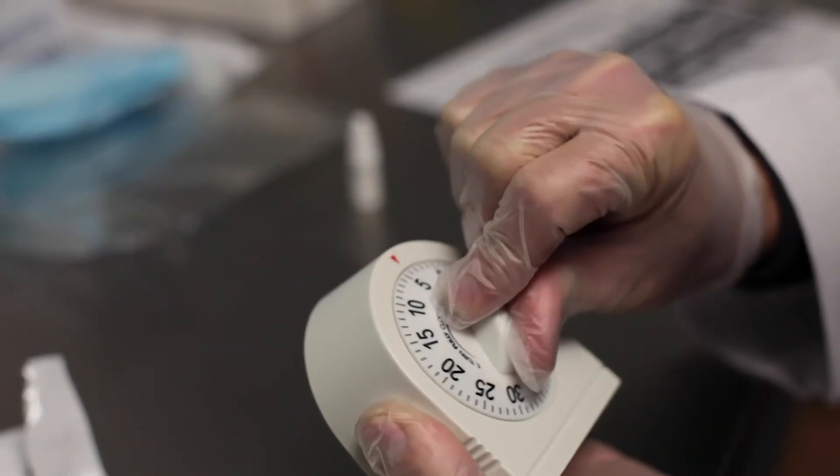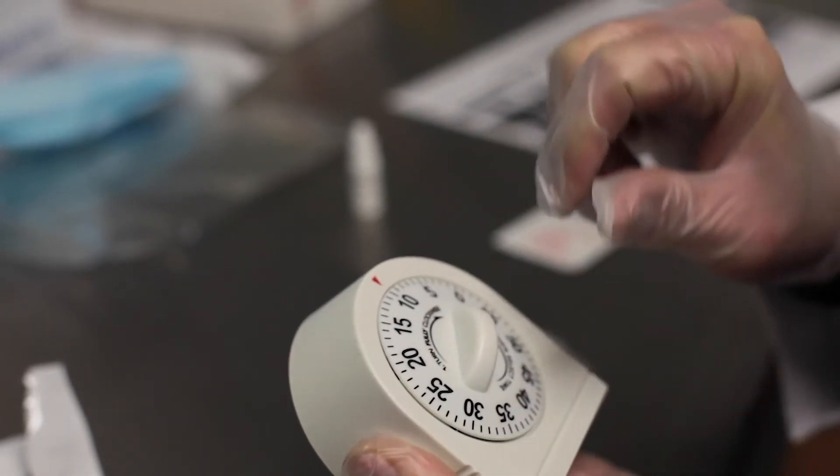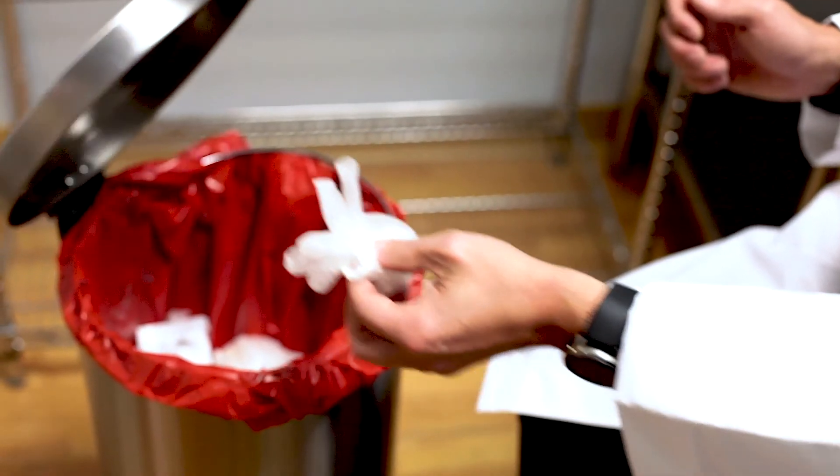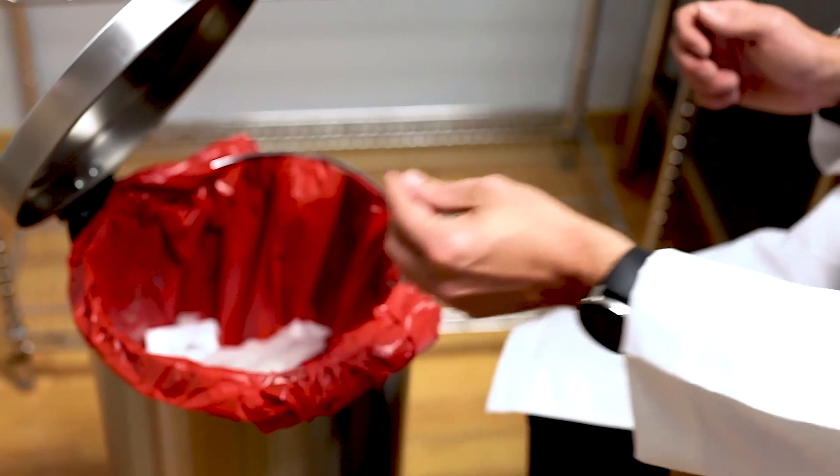Set a timer and read your results in 10-20 minutes. Be sure not to read results after 20 minutes in order to ensure there are no false results. Afterwards, ensure to properly dispose of all PPE when complete.